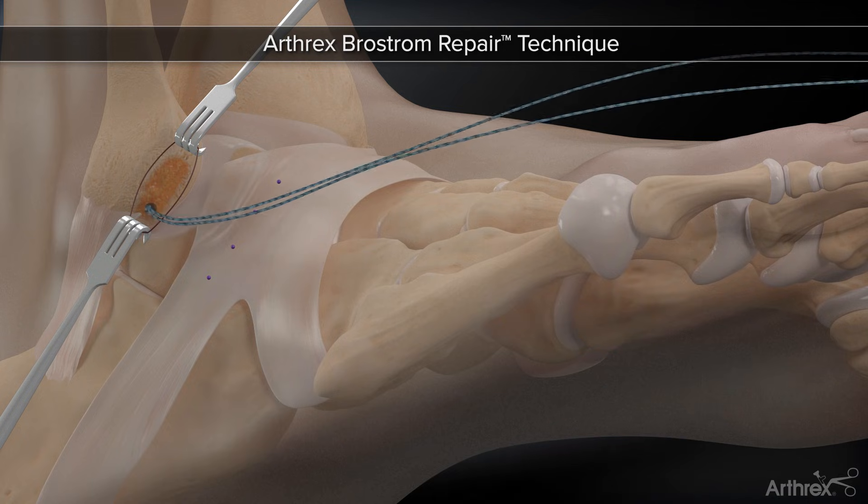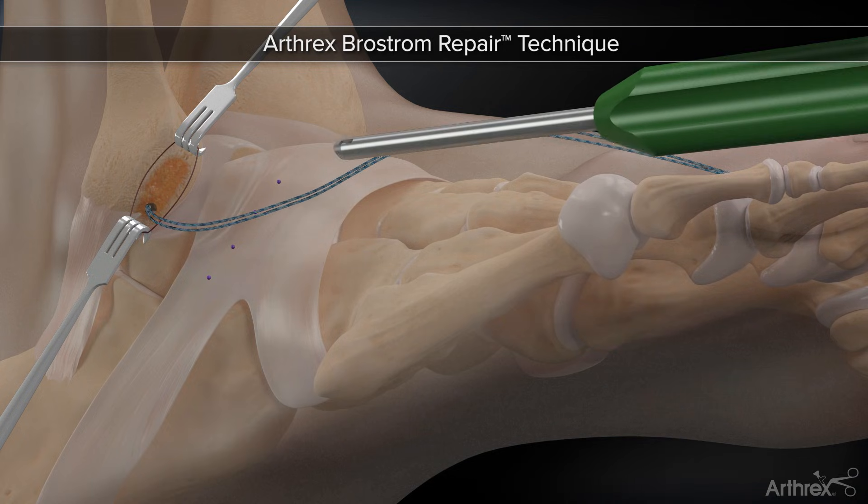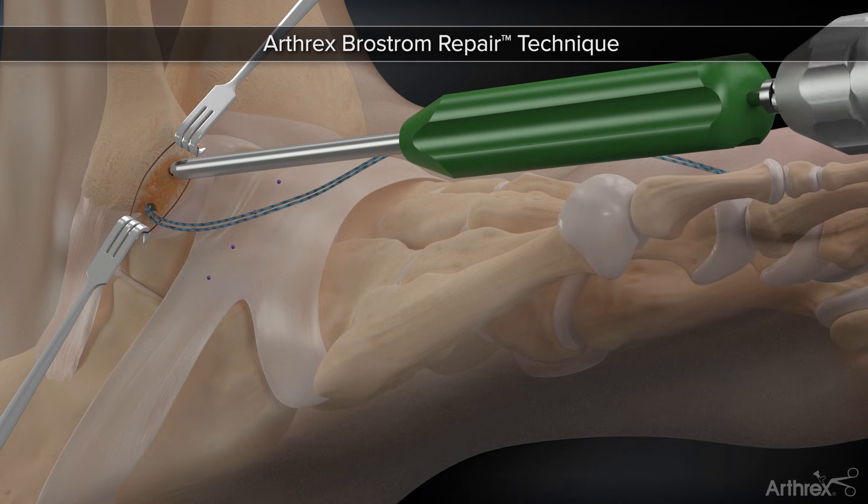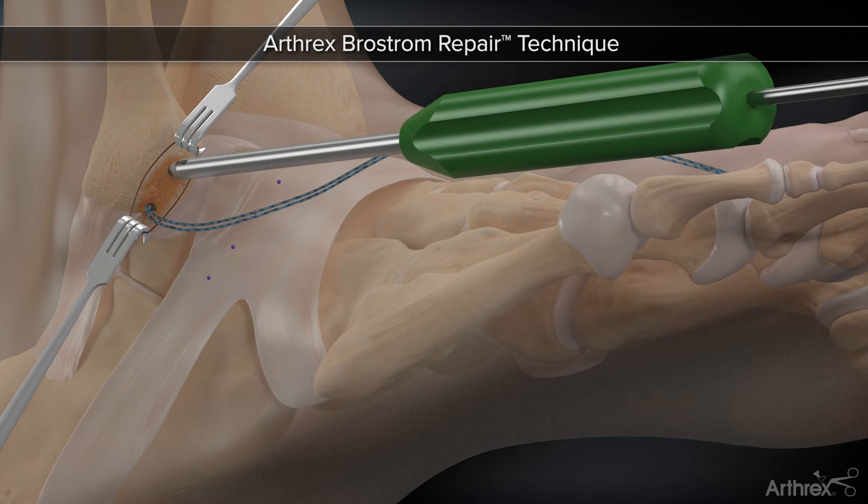Subsequently, another drill tunnel is created in a similar fashion, approximately 1 cm proximal to the location of the first anchor. Insert the second suture tech anchor until it is flushed with the black line at the back of the handle.